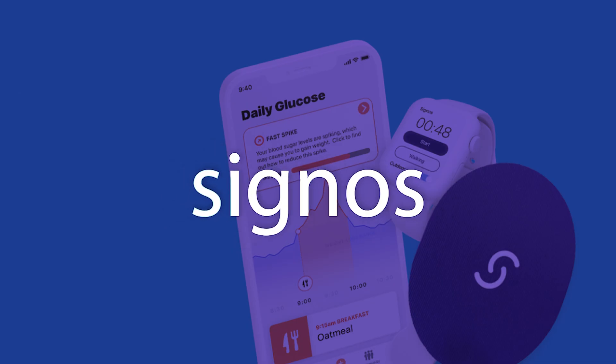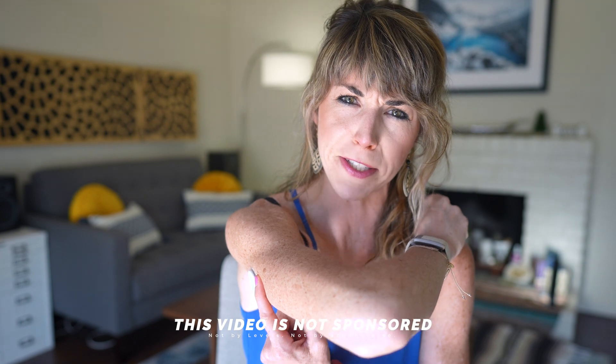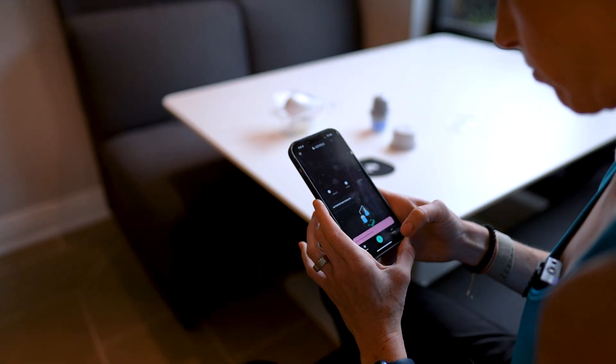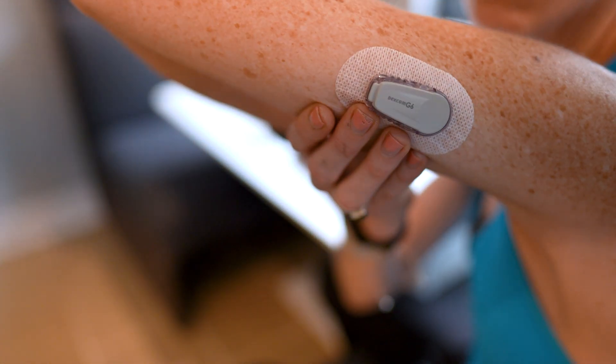What's up friends, and welcome back to the channel. So when it comes to picking out a CGM, there are a lot of companies that you can choose from, but really only one option when it comes to the actual sensor — that is, up until now. Levels actually just introduced the new Dexcom G6 onto their platform.